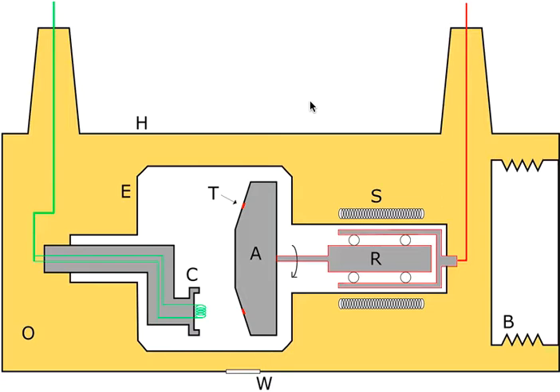I'm going to try to keep it short and let's start by talking about the cathode and the anode, which are going to be the main players on this. The cathode is negatively charged and the anode is the positively charged component.